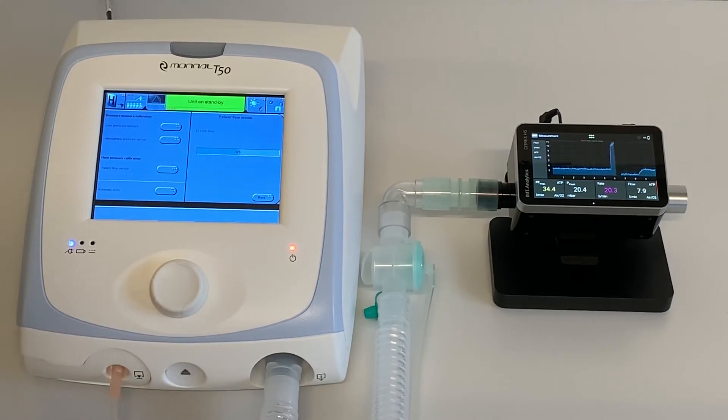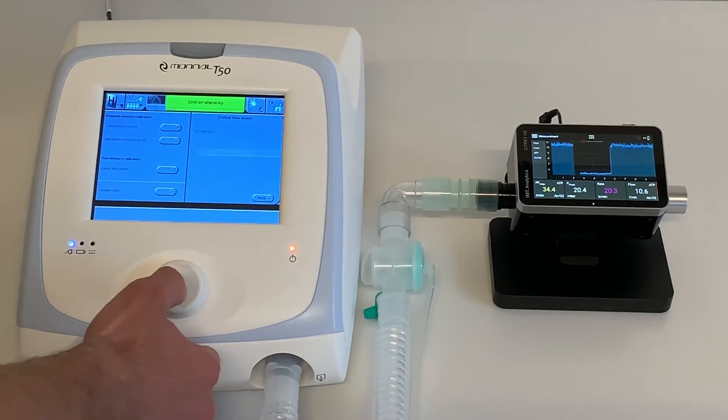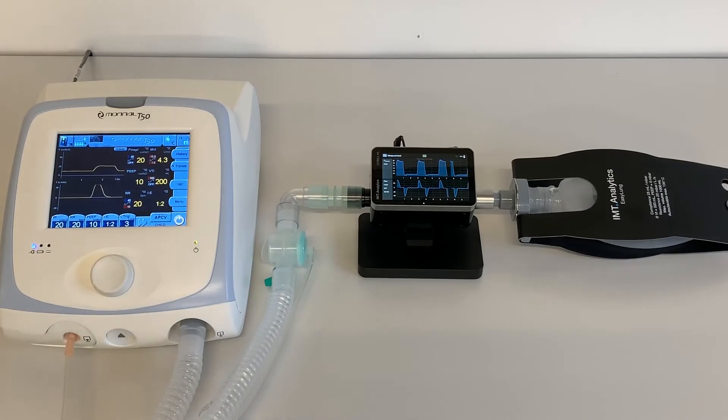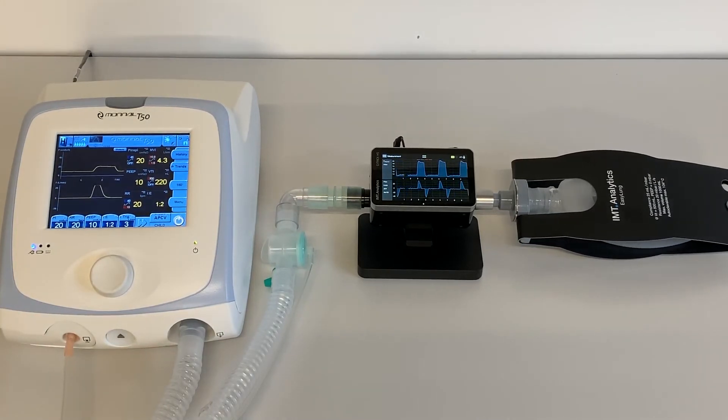Verify the T50 is delivering a flow of 10 liters per minute on the Citrex, then press the control knob to confirm. Continue according to the screen information until all parameters are verified and the test is successfully completed.